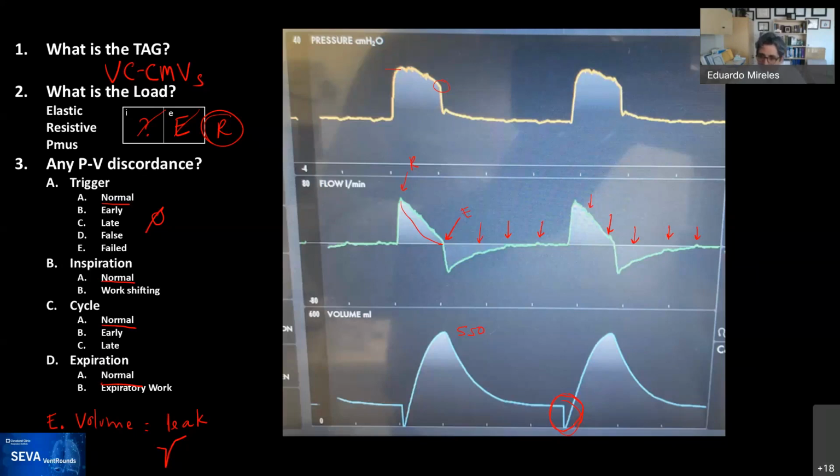Any other thoughts, Rob? Keep in mind that we're just assuming pressure control with set point targeting. Yes. You've got adaptive targeting, you can set a target tidal volume, and other things being equal, you could do exactly the same thing as you could with volume control. Absolutely. Absolutely.